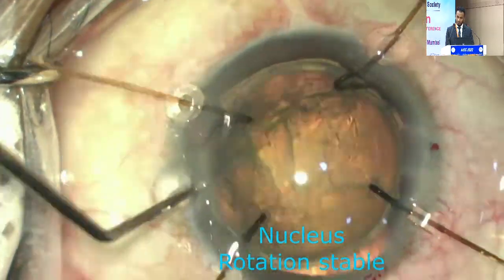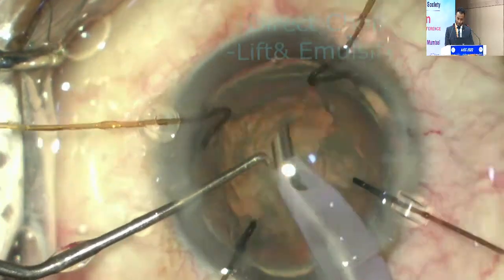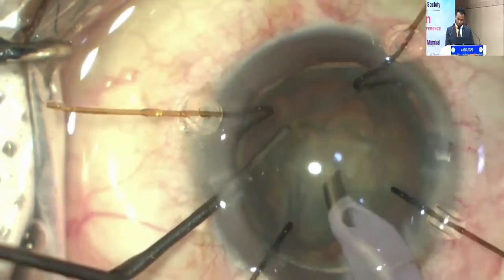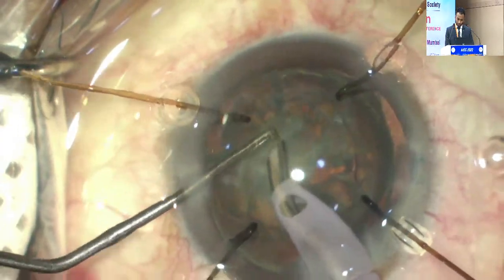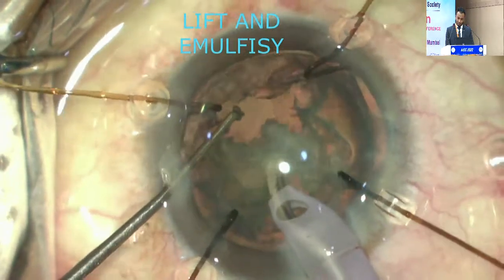And then I've decided to rotate it because it has distributed the forces well. The anterior zonules were pretty fine. Going ahead with the phaco surgery, lower parameters, a direct chop technique. Important is to lift it slightly in the capsular plane or the iris plane and remove the pieces because it will prevent the bag stress. You lift it with your second instrument and get it in the central safe zone and emulsify it.